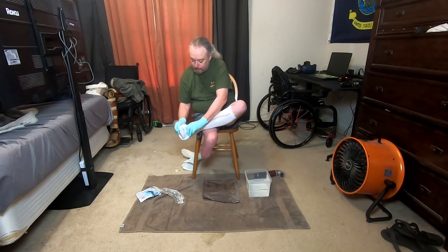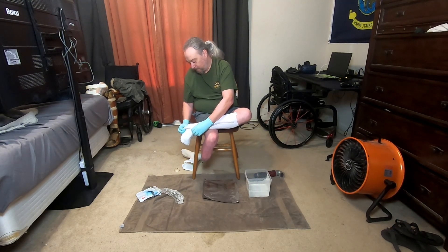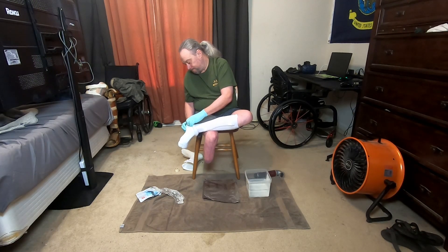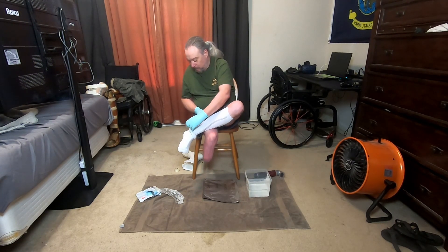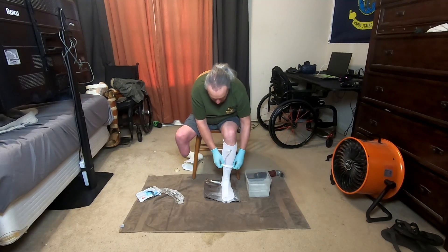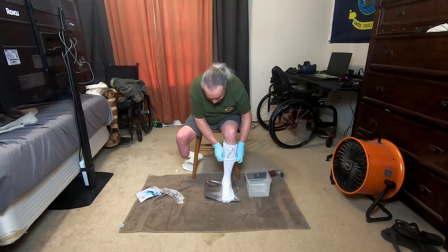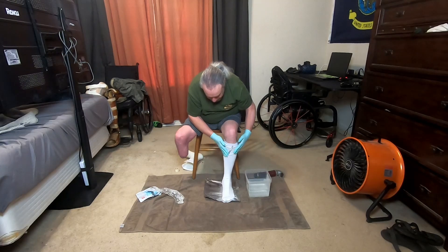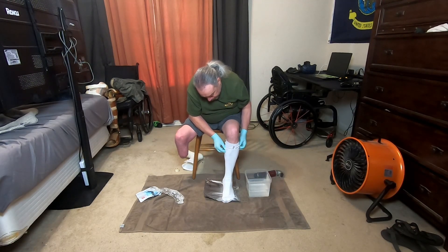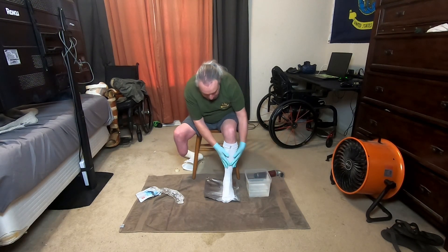Get the toes on and start unrolling it nice and smooth. Over the heel, and just continue to roll it on as high up as you can get it. Now I can already feel it getting warm, so I can tell the chemical reaction has really started.